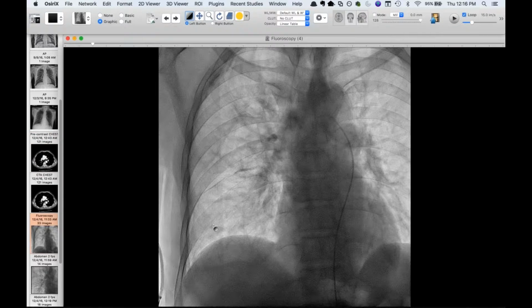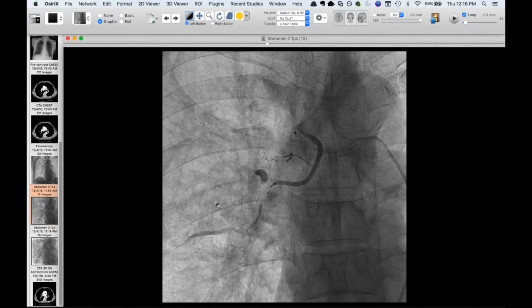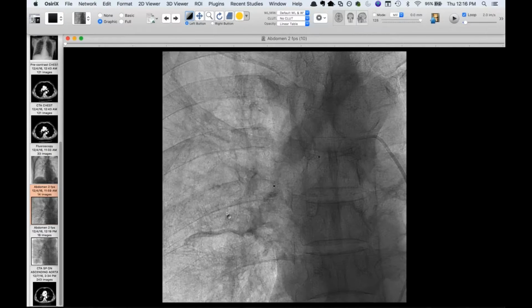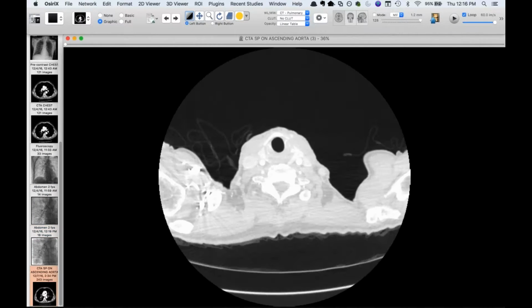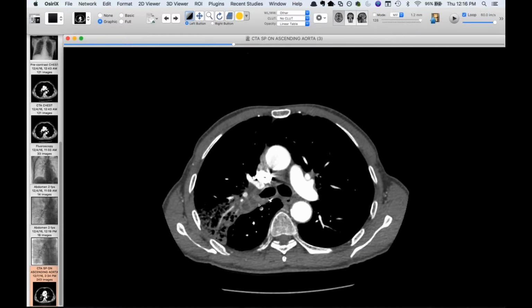And I will show you the angio images here. This is just, I guess, a proximally selective bronchial artery injection, and you can see this thing lighting up. And then they do a more selective, and there you can see this partially thrombosed bronchial artery pseudoaneurysm. And so then they put some coils in it, and it's not filling anymore. And then, of course, yesterday, just because they can, they got a follow-up radiograph or CT, and you'll see now that there's no filling of this.